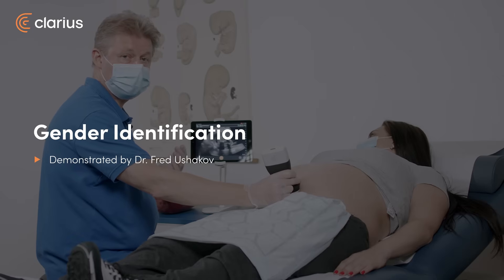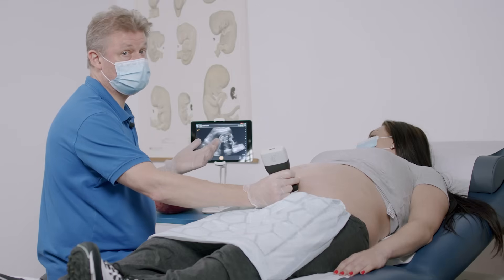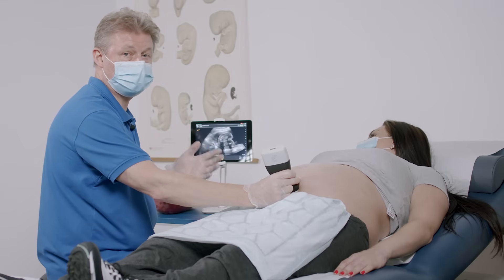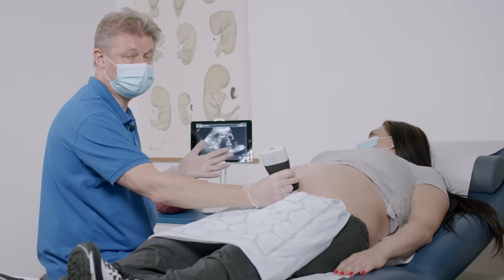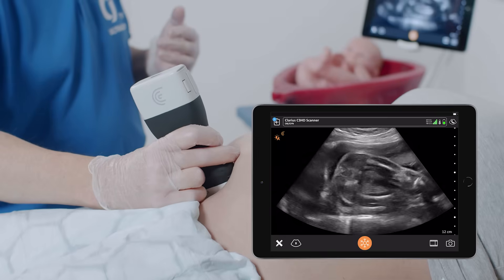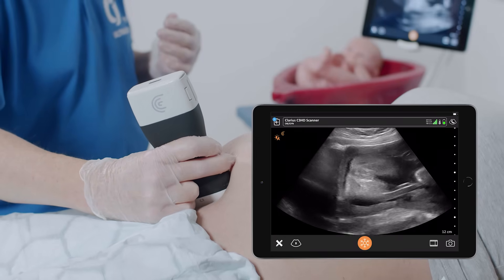Some parents would like to know the baby's gender, and ultrasound is very important for them just for gender review. Others don't want to know the gender, so it's better to ask every time you are doing the scan if the parents are interested in gender review. I will show you how you can try to see the gender of the baby.